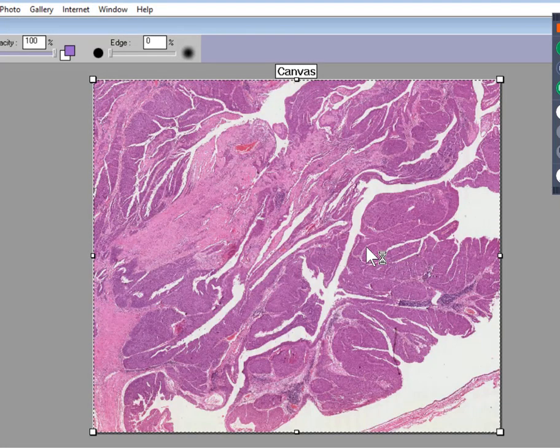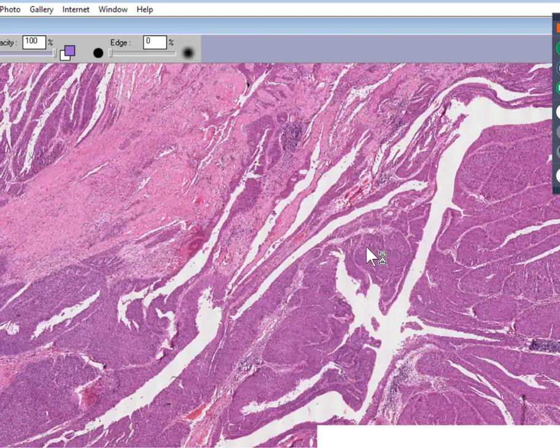And what do we see? Well, we see blue areas and we see pinker areas. And we can also say, probably without having to convince you too much, that the tumor cells are the darker, bluer cells, but they happen to be growing almost like fingers.